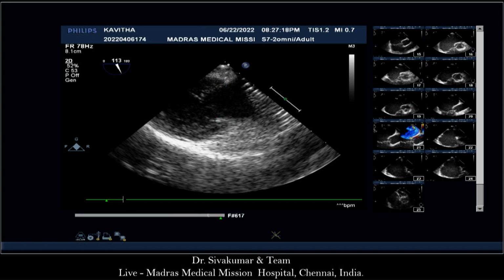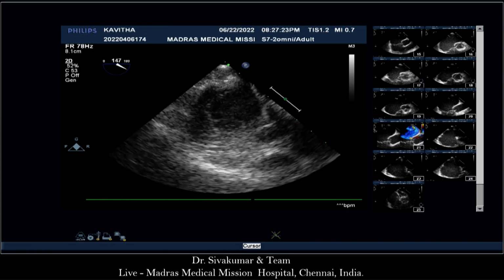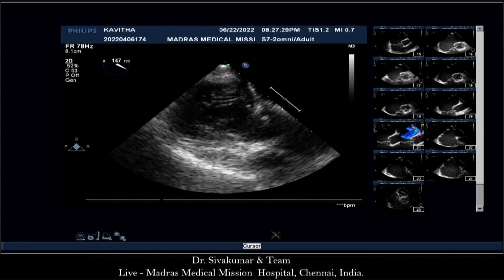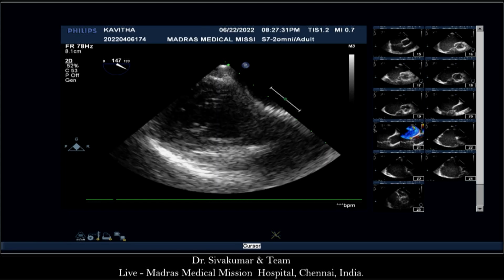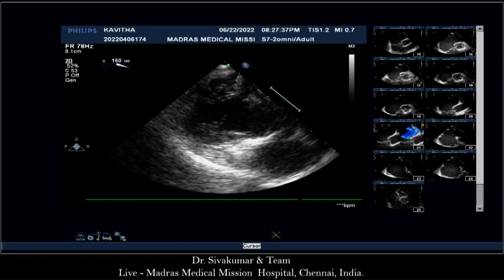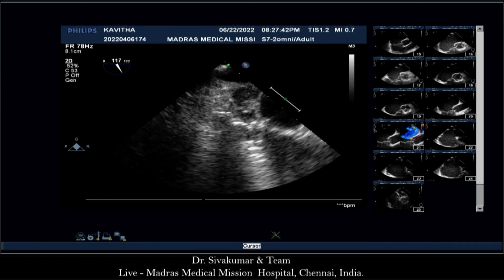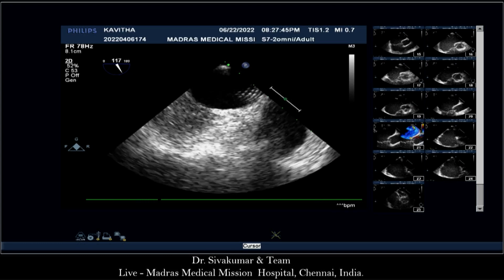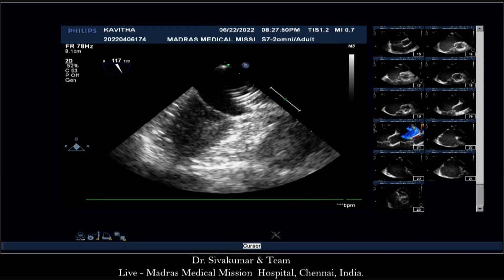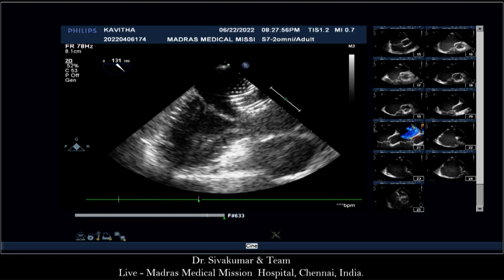Shiva, on the echo, if you just try 150 angle, yeah, and now rotate towards the atrial roof. Show the left atrial roof. Oh, yeah. I have to come out. I am in transgastric now. All right, yeah, okay. I will get it out. Now I will show you the long axis view. This is the mitral valve. That's it. Yeah, but go 150. Pretty close. I'll freeze it and show you. Okay.